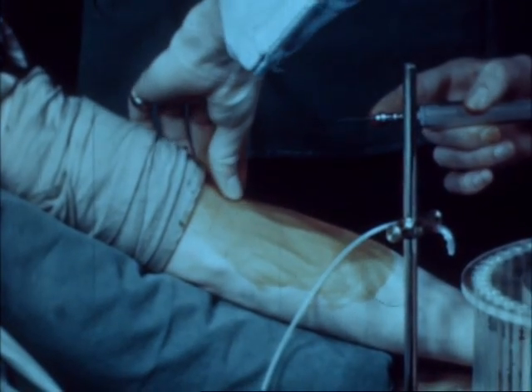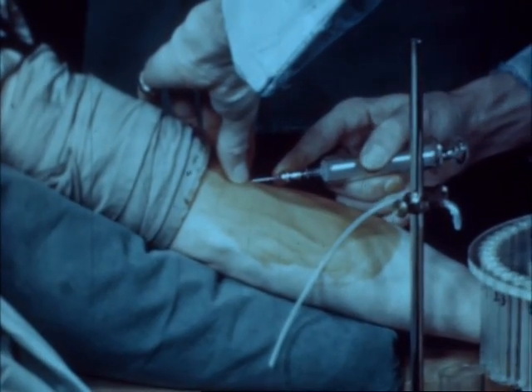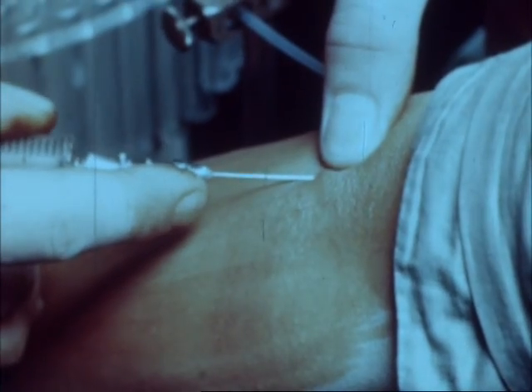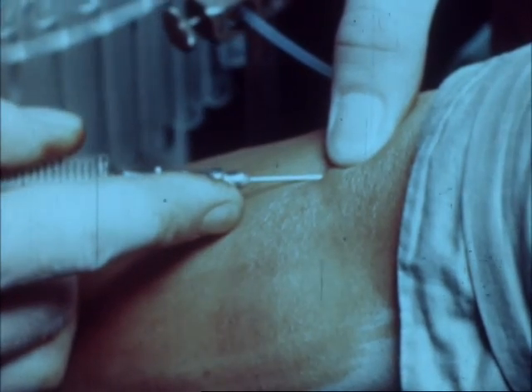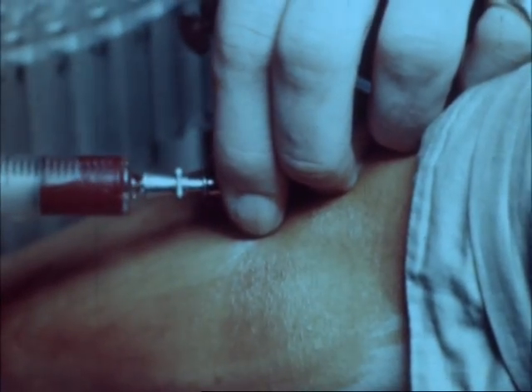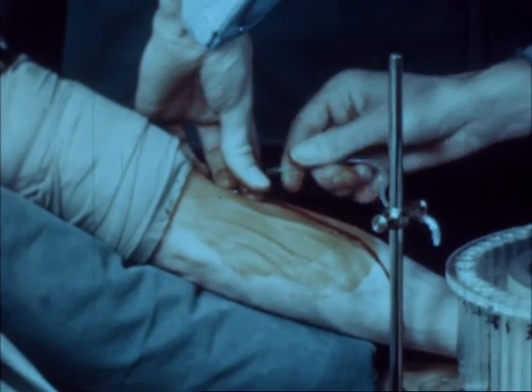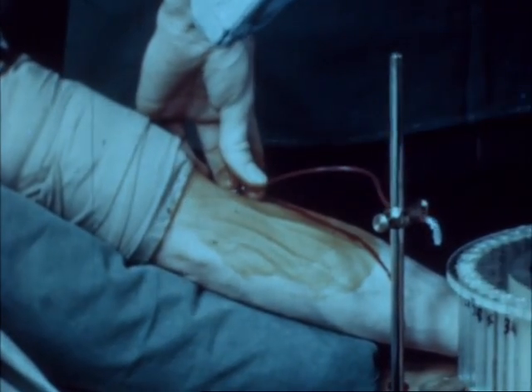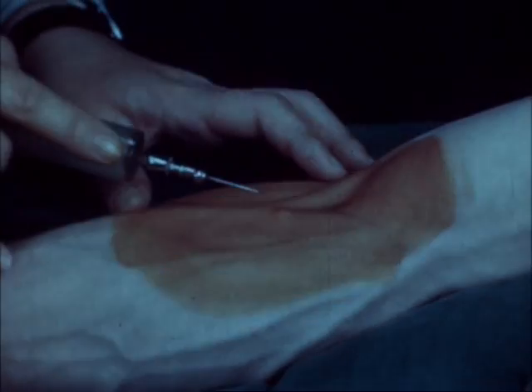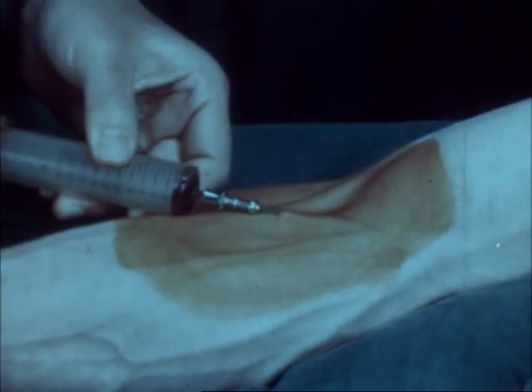A needle is now inserted through the anesthetized skin into the brachial artery, and the plastic tubing is connected to the hub of the needle. The blood is at first directed into a large boiling tube. A blank sample of venous blood is withdrawn from the right arm.